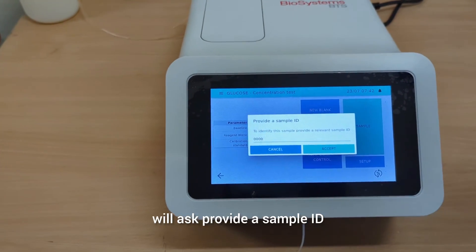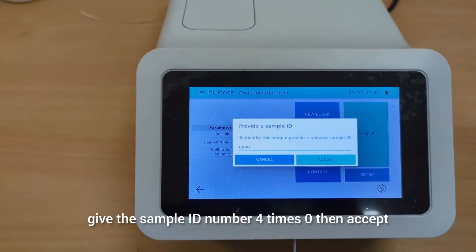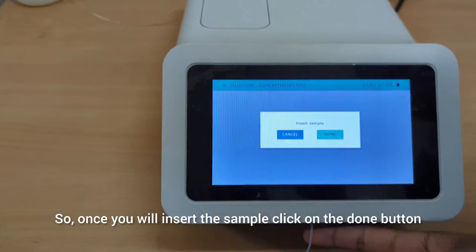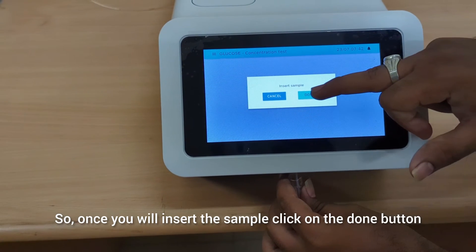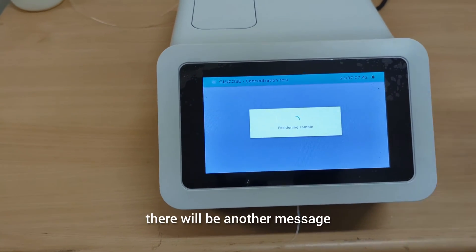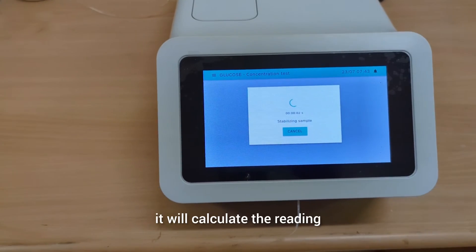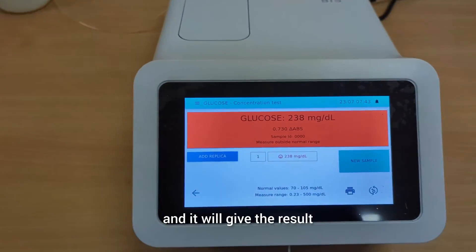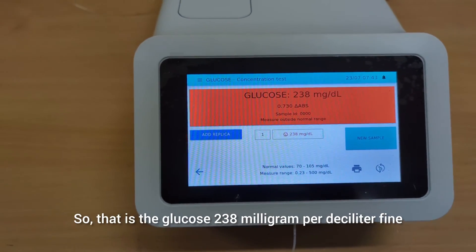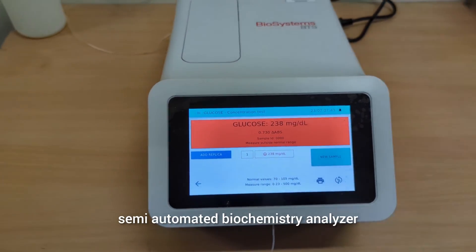Once you click on sample, it will ask you to provide a sample ID. For example, enter sample ID 4000 and accept it. Then insert the sample and click the done button. It will aspirate the sample, and after aspiration a message will say remove the sample. Remove it and the instrument will calculate the reading and give the result. The glucose result for our sample is 238 milligram per deciliter.